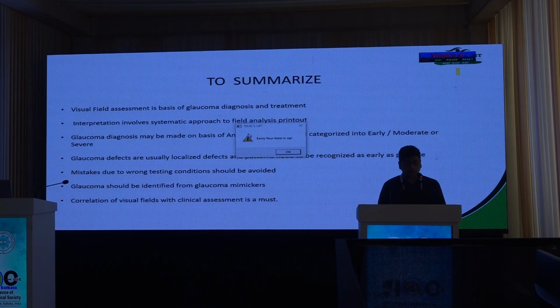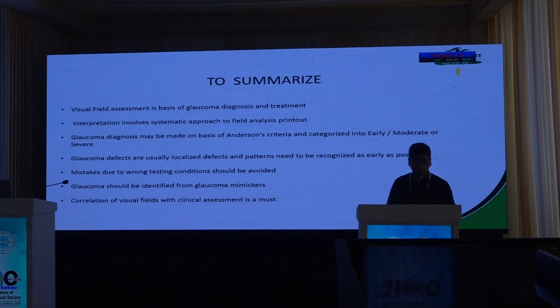And we need to further identify it from glaucoma mimickers, and correlation of the fields with the clinical condition is a must.